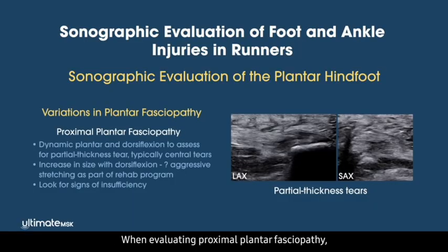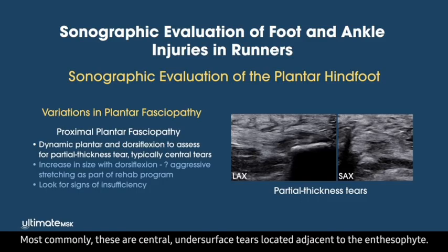When evaluating proximal plantar fasciopathy, it's important to assess for a tear. To do this, I perform dynamic plantar and dorsiflexion, which often better reveals the extent of the tear. Most commonly, these are central undersurface tears located adjacent to the enthesiophyte.